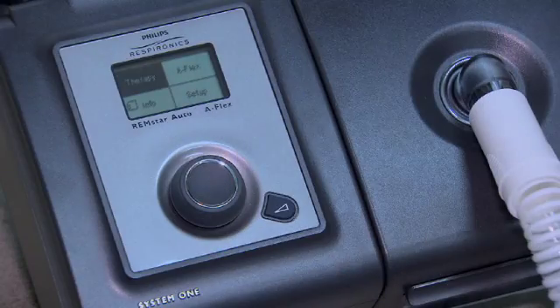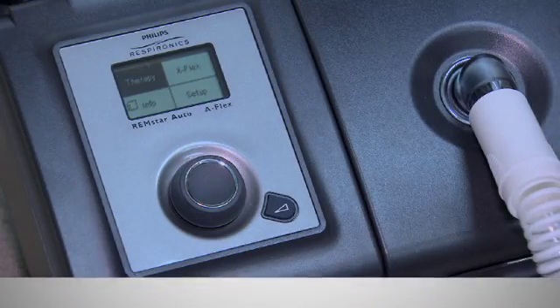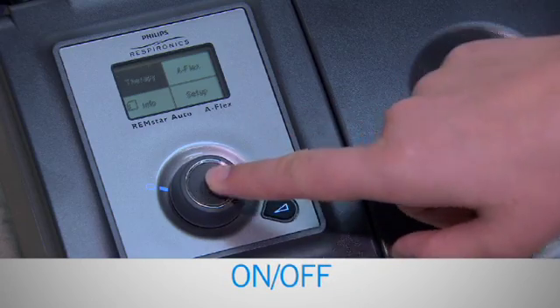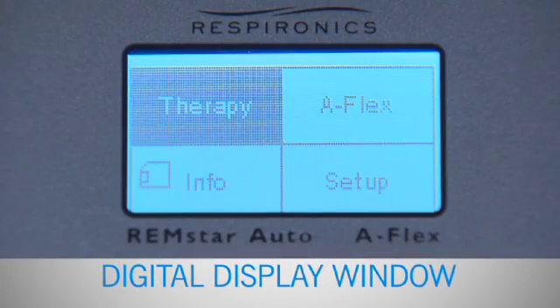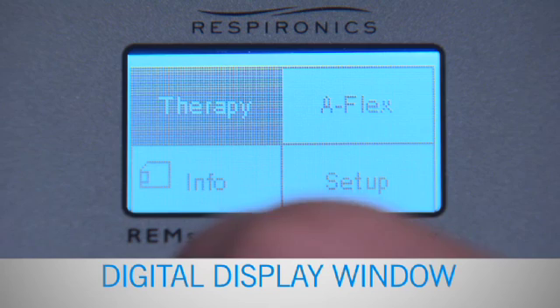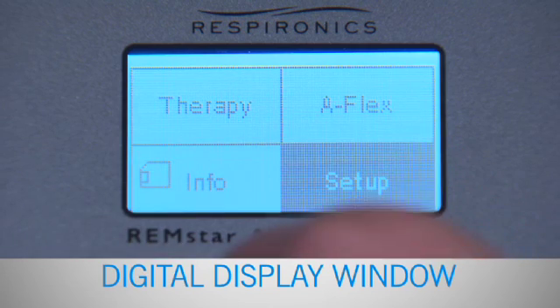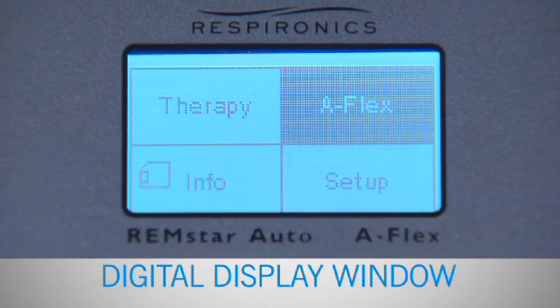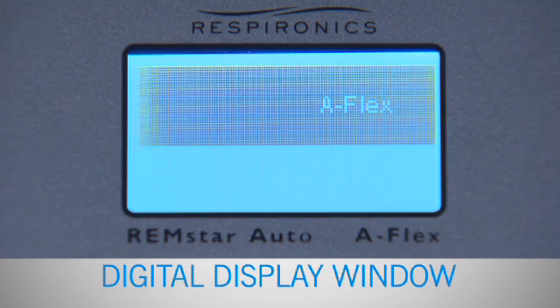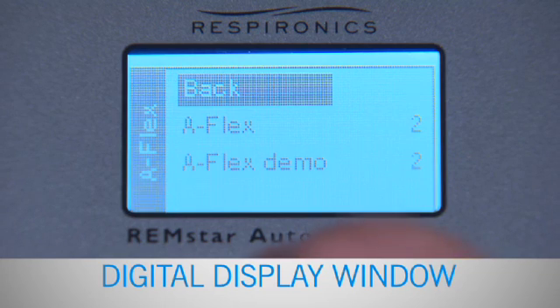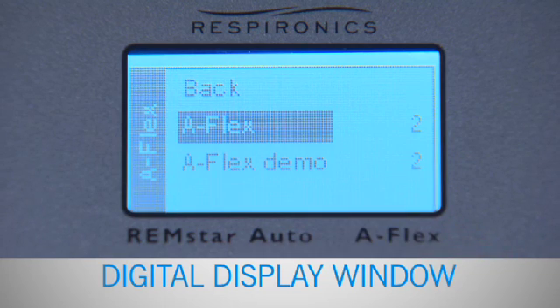Your PAP machine will have a main control knob for turning it on and off. There's a digital display window that will show the pressure set on the machine. This window may display additional information depending on how your respiratory therapist sets the parameters.